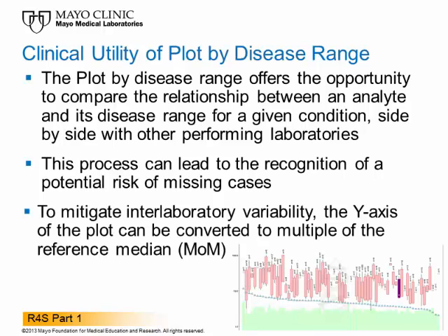the disease range can be switched to the same format of a plot by condition, a logarithmic scale, and conversion of cutoff and percentile ranges to multiples of a reference median. In the example shown in the insert, the sites are sorted by descending order of cutoff value. It should be evident that the cutoff values on the left side of the plot are less than ideal, and they are higher than significant portions of the disease ranges from other sites.